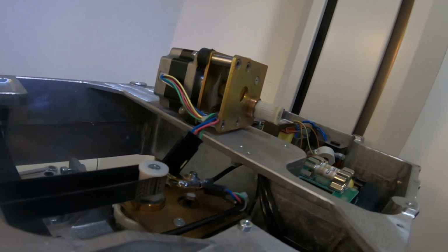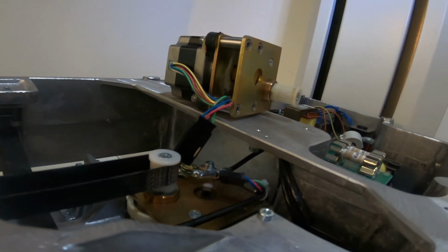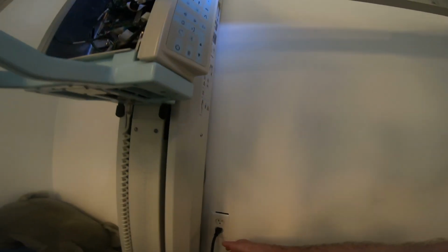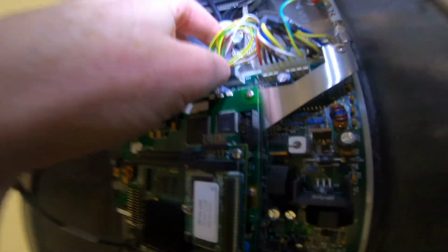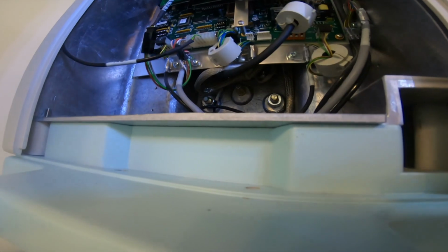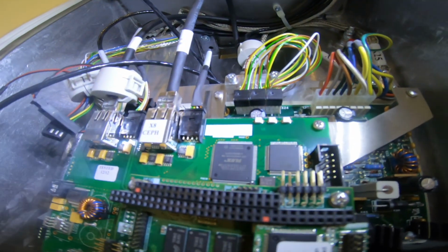The middle 4 pins are fine when they're hooked up with a different wire than the R wire. So all of the pins on the board seem to be okay. It's just that the pins connected to a motor with the R wire don't work on the motor. So it's got to be that wire. How could a wire be messed up? It's just wires.